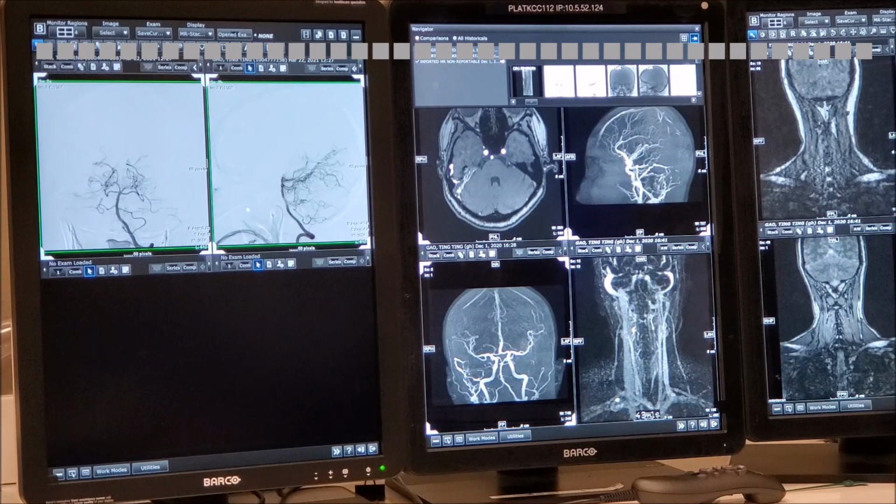So posterior meningeal from vertebral. Yes. And also some of the other ECA branches that dig into the skull. Which one is my favorite artery? The smallest, call it the most dangerous, smartest artery of the external carotid artery, the ascending pharyngeal. The ascending pharyngeal is such a fascinating artery. The ascending pharyngeal and the occipital have the same autoregulation as the cerebral arteries, whereas the internal maxillary may, but the facial and lingual do not have. They are like systemic blood vessels.